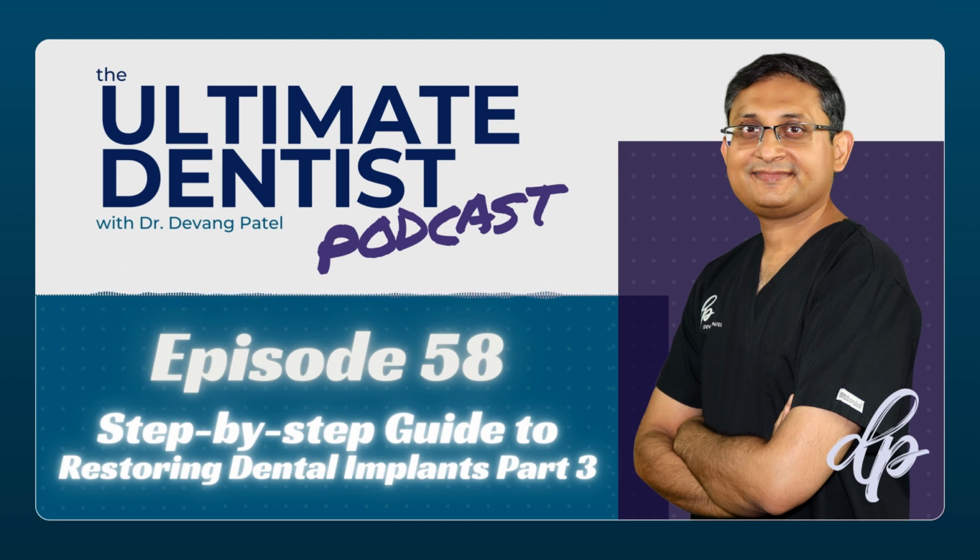But you need to mention that to the technician, and then any other specific detail, like what type of abutment you want, what size of abutment you want, narrow abutment, wider abutment, what height you want of the abutment. I prefer, if my implant is deep by 1 millimeter, I want a longer abutment. So ideally your abutment should clear the bone around the implant, and then your crown can create the emergence profile.